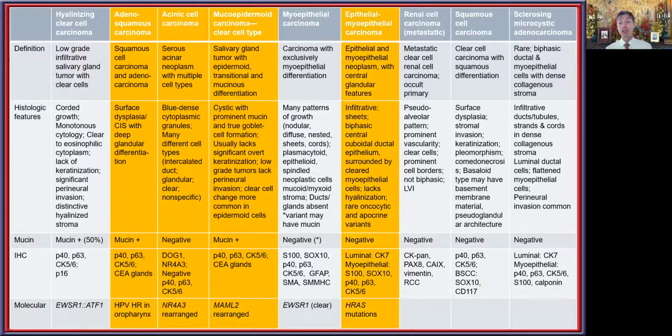Now you can tell from these that there is cleared cytoplasm, but it is not always the case. So I am highlighting it here because we're talking about clear cell tumors and their differentials, but just recognize that myoepithelial cells can be eosinophilic to opaque cytoplasm as well, and not always just a clear cell compartment. The nice thing about the immunophenotype in this case is that, again, it's going to be a single cell population, but with a variety of different markers.